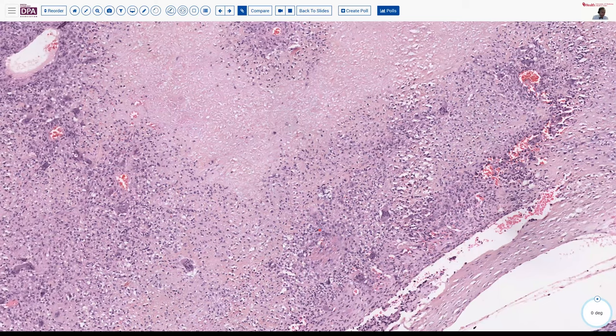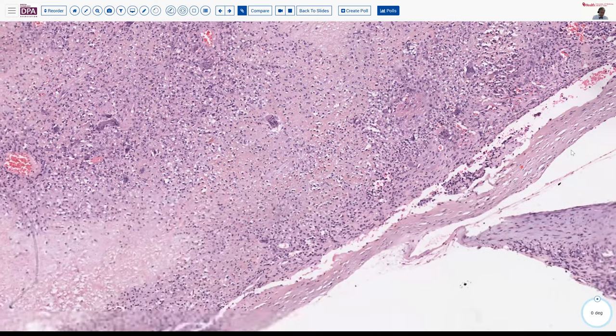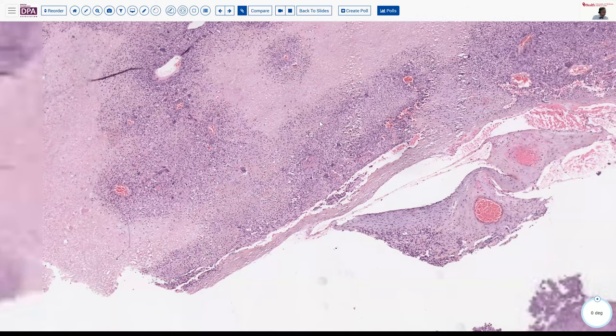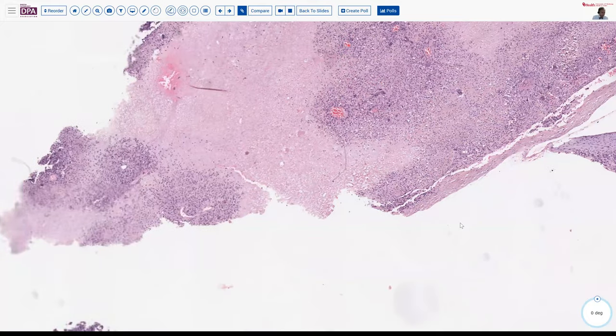We see giant cells in these lesions, as with many bone lesions. And here's maybe the beginnings of a cyst lining, underscoring that these lesions can become cystic at times. We'll look a little bit more at some of this pinkish tissue. Let's look in the other fragment.